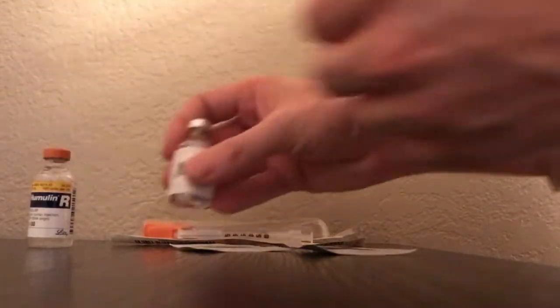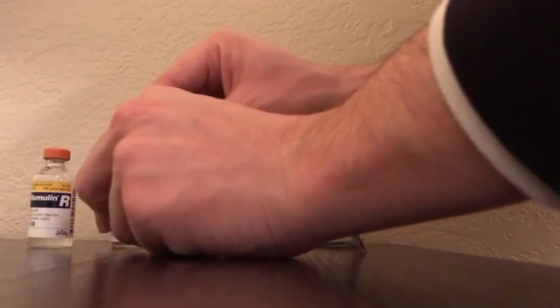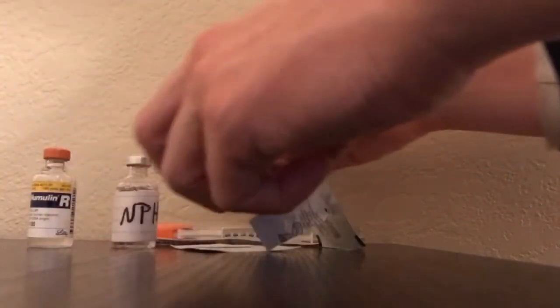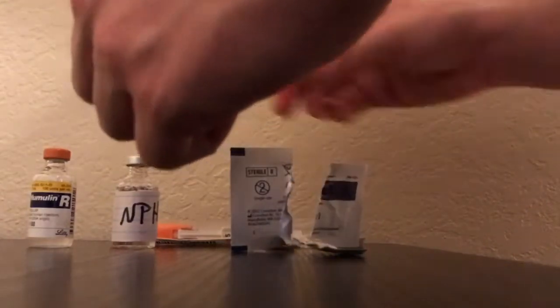Grab your alcohol swab and clean the top of the NPH vial for about five to ten seconds, then allow it to dry. Use a different alcohol swab to clean the clear vial. You don't want to use the same one because you'll be cross-contaminating both of them. Allow that to dry as well.